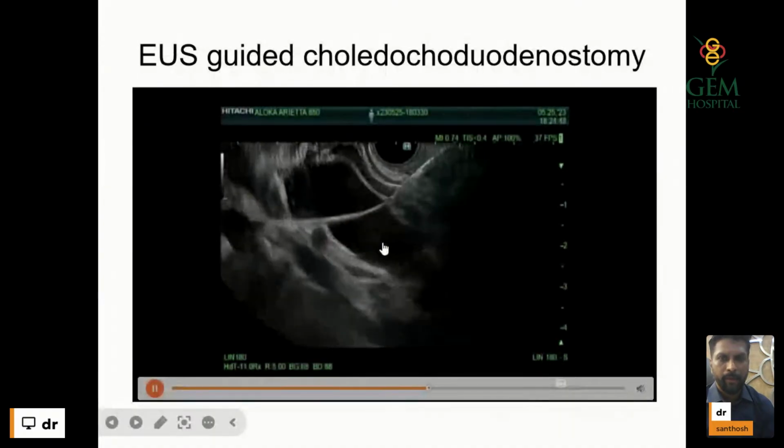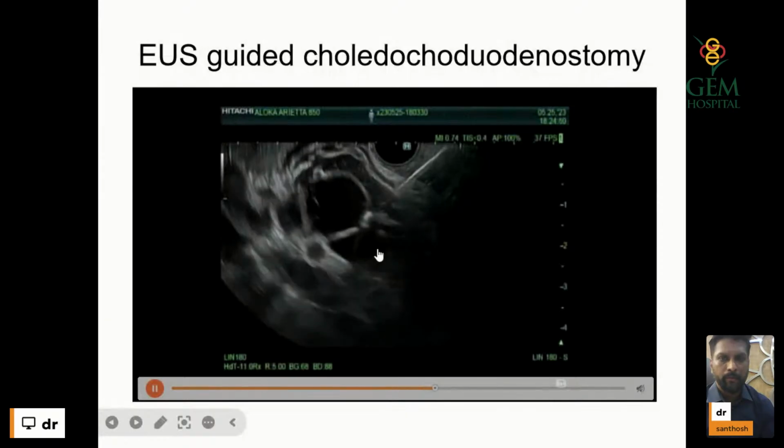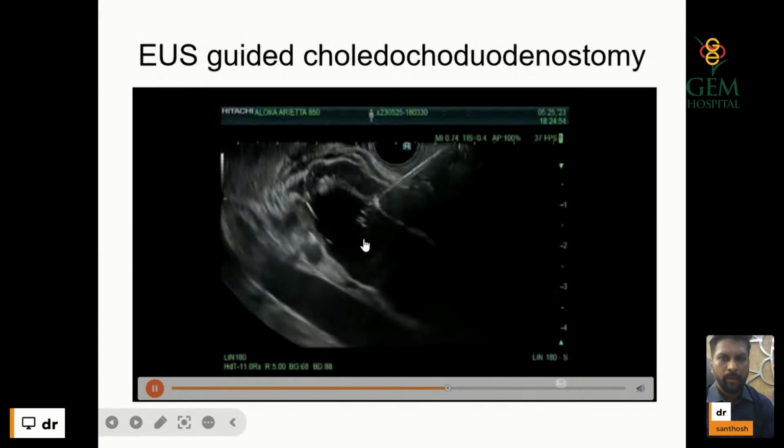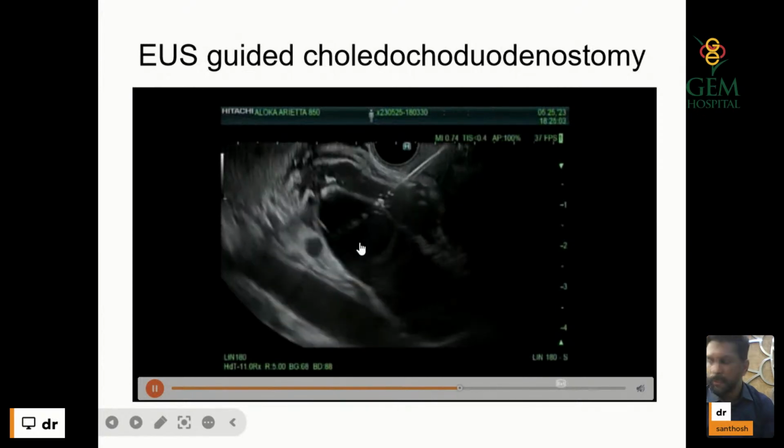Puncture CBD. Then deploy the distal flange.